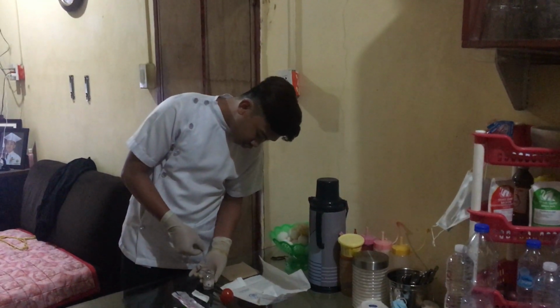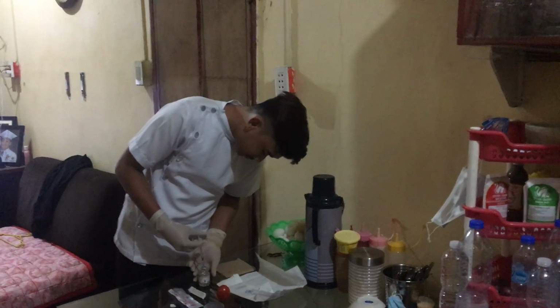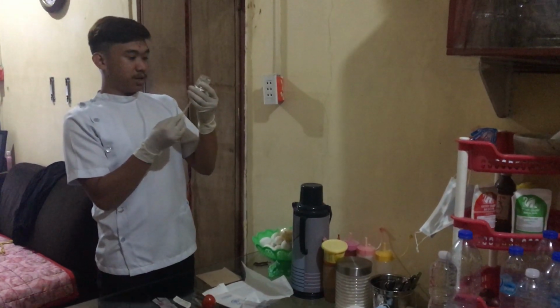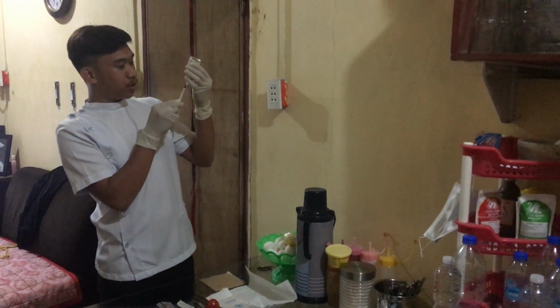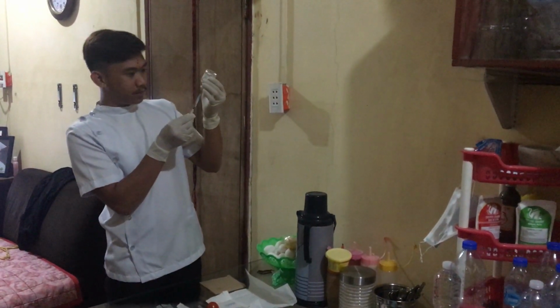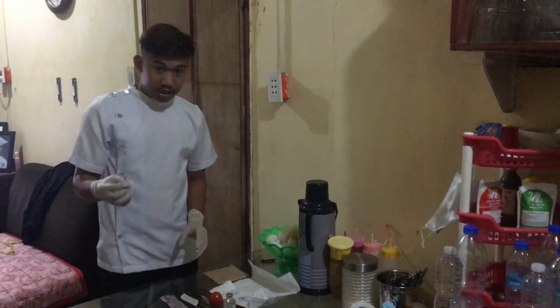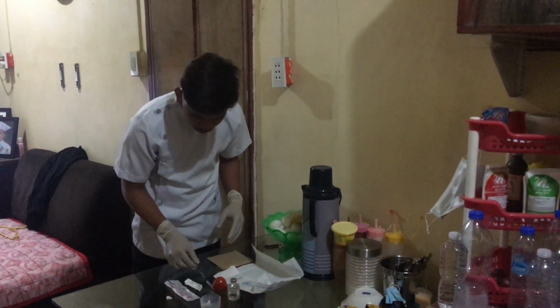So we are going to build up negative pressure in the vial, and I'm going to start aspirating the medicine. 0.5 cc. Okay, 0.5. Then I'm going to put the medicine on a flat surface. And then I'm going to cap the aspirating needle by the scoop method.